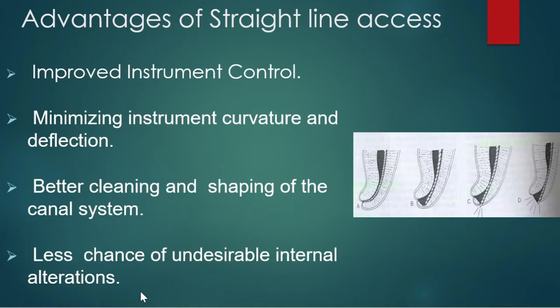So straight line access will increase the operator's ability to manipulate files in as many areas of the canals as possible without changing the internal canal anatomy. It will also help in better shaping and cleaning of the canal system with less chance of ledging, zipping, or transportations.